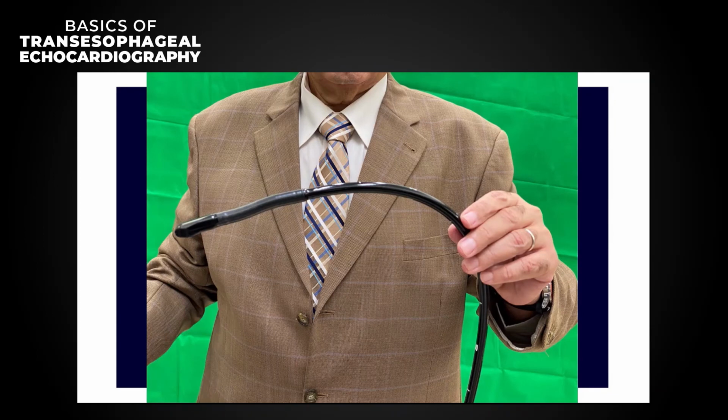What's the difference between adult and pediatric TEE? The difference between the adult and the pediatric TEE is the size of the probe. Pediatric TEEs are very small, and I saw before a very small pediatric TEE, and this was transnasal. They put it through the nose into the esophagus at pediatric age. But in general, the pediatric TEE is smaller in size compared with adults.